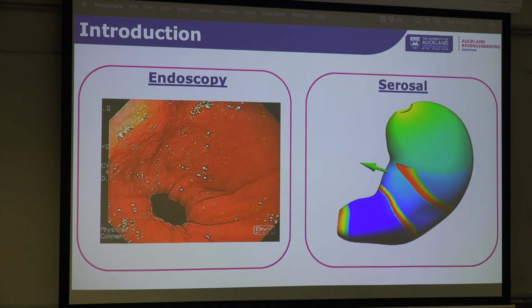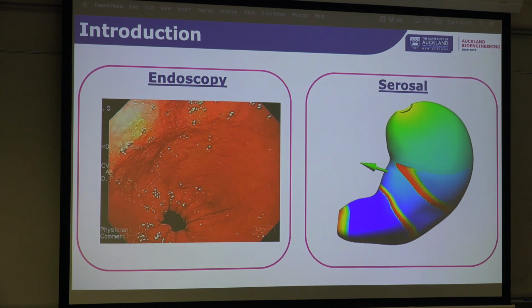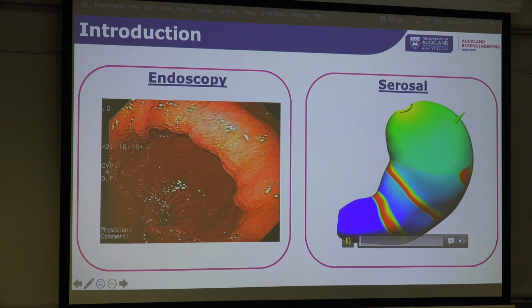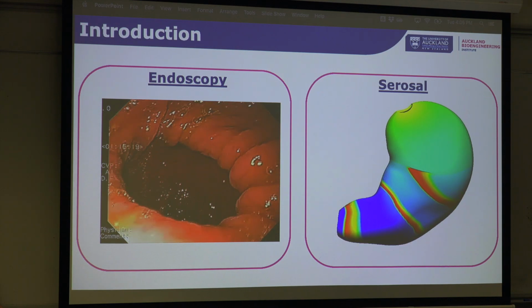This is to help break down food and push food from the stomach into the lower GI tract. Now, if we look at this serosally on the stomach surface, we get waves that look like this. Here we can see those 3 waves per minute, rapidly depolarizing circumferentially, and then moving longitudinally down the stomach, which is functionally pushing that food down into the lower GI tract.